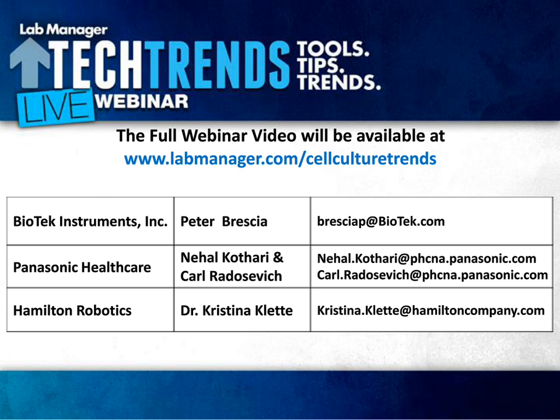Great, thank you. So if you are bringing a new cell line into your lab, what protocols would you suggest to avoid cross-contamination? Well, I think it depends on where your source is. A lot of times, you can order in a cell line from a good source like ATCC. It's been confirmed that you're actually working with a cell line that's of interest.